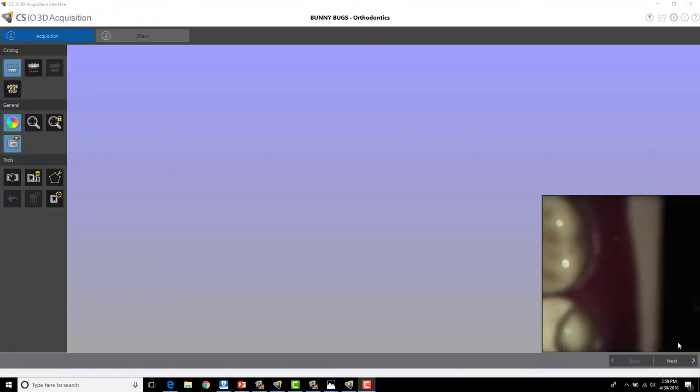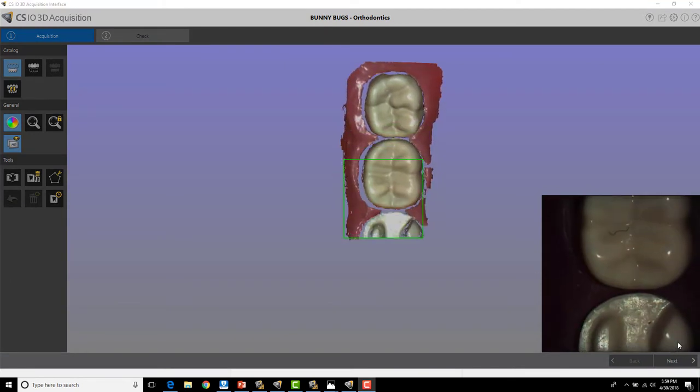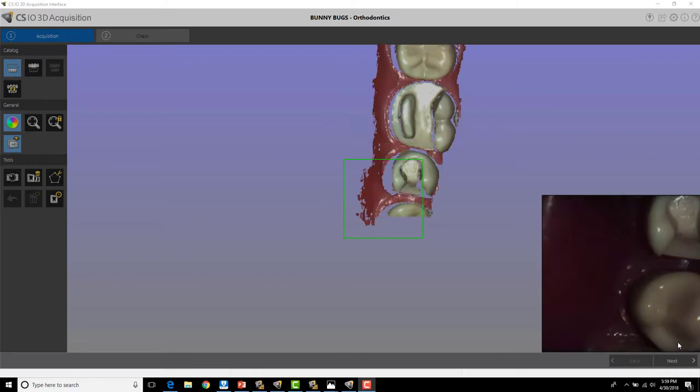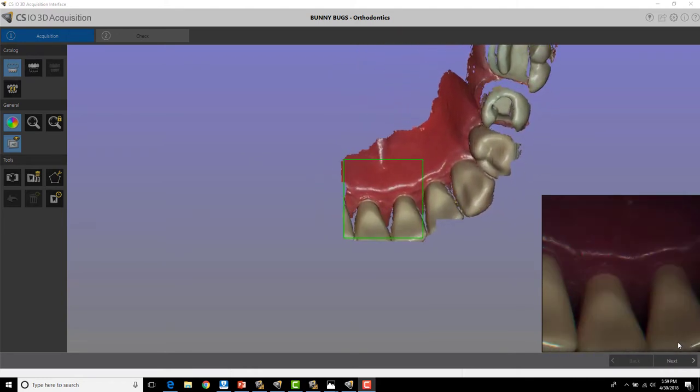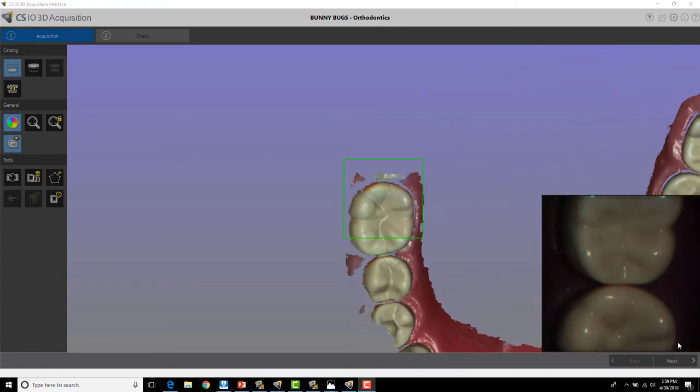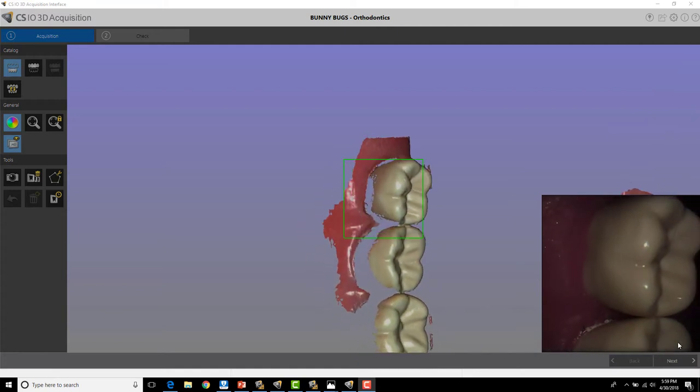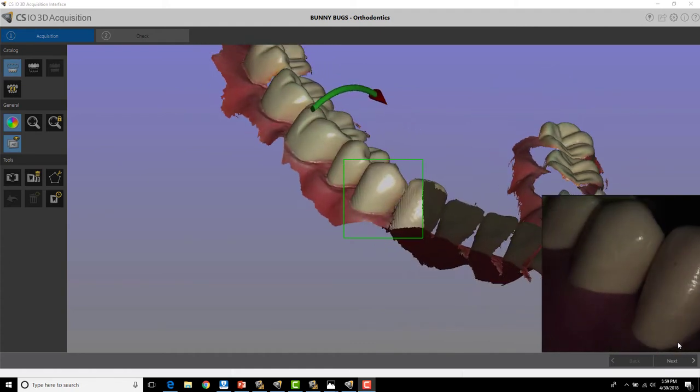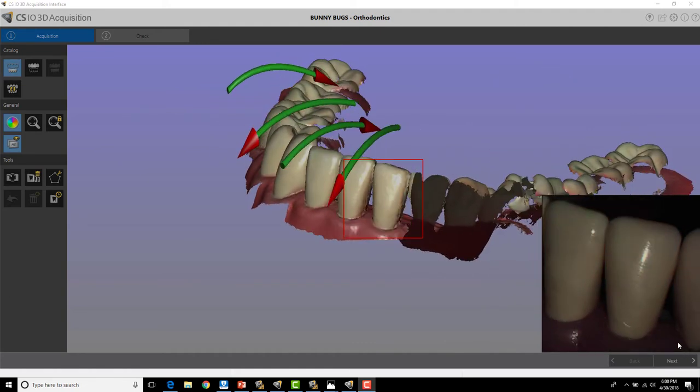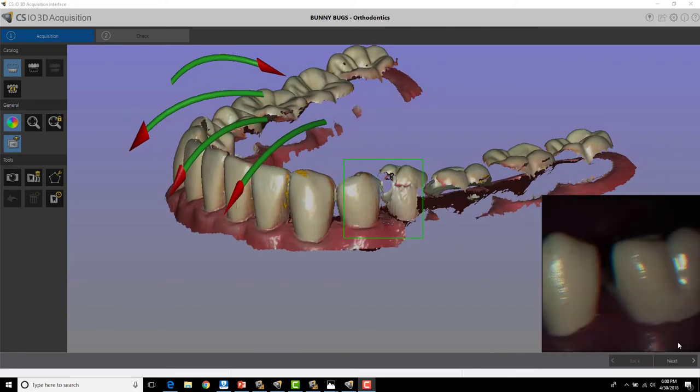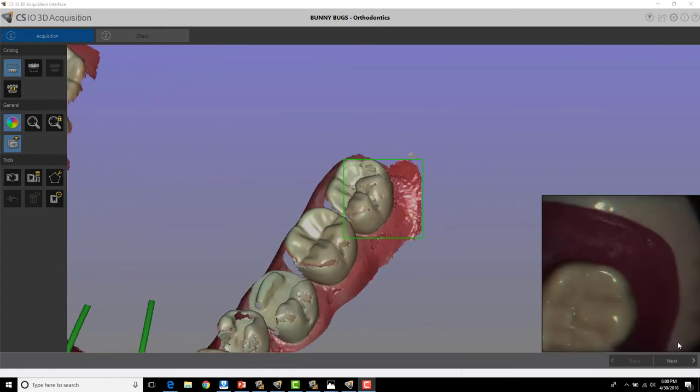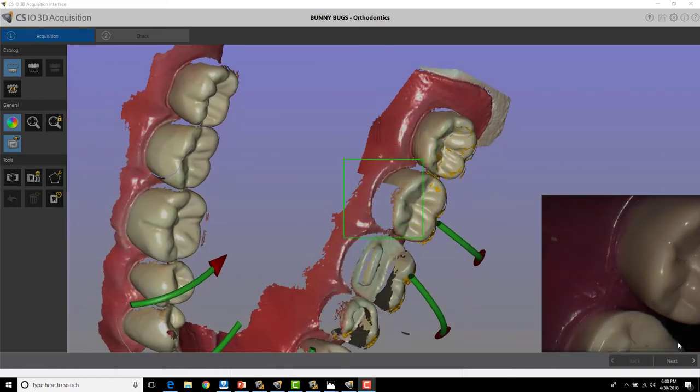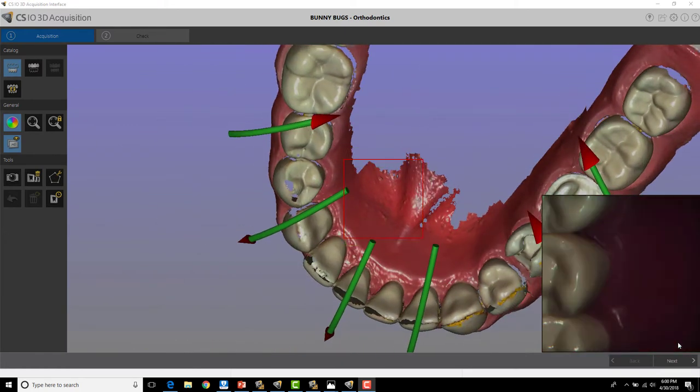So this is a common scanning technique and possible error by new users. You'll start off in the posterior on the occlusal aspect. You'll work your way to the anterior and you'll tend to air towards the lingual like that. And then you'll finish around the arch, work your way around the buckle, then do more of a straight buckle shot like that. And of course, work your way around and do the lingual. You'll finish your scan like that.